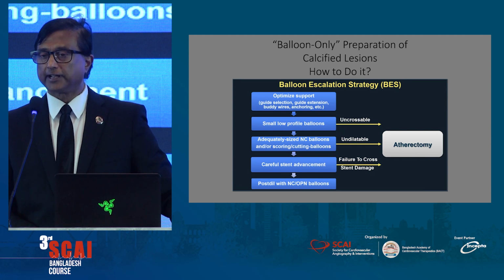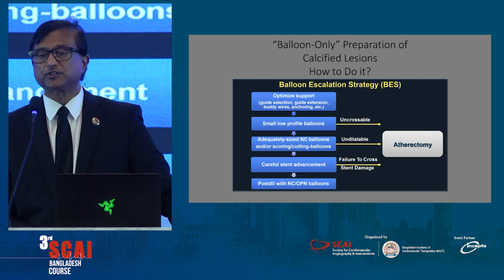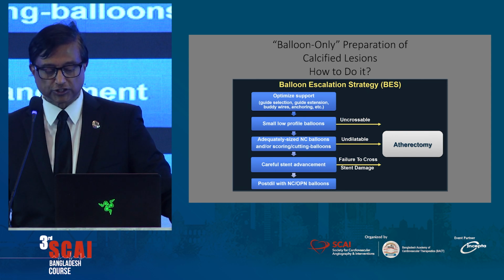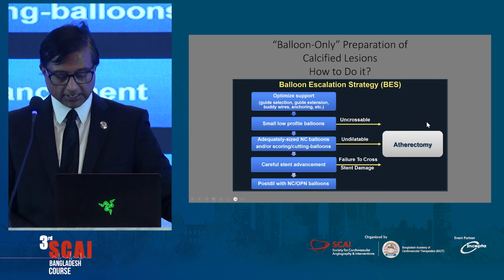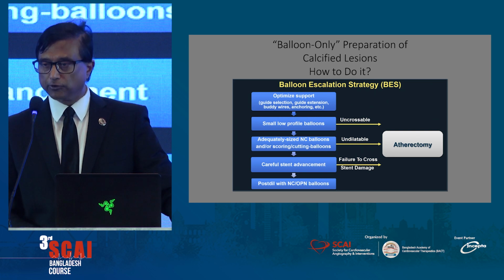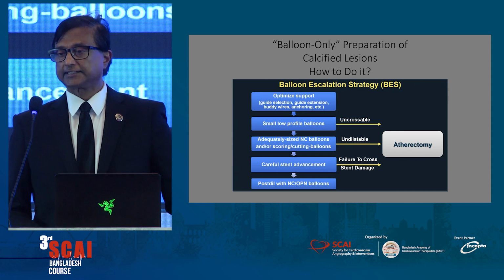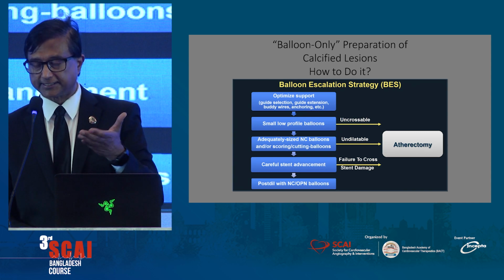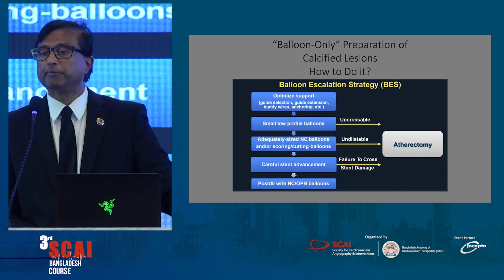You may hope for it, and many times you may be able to get away with it, but sometimes you may not be able to get away with it. So it is better to prepare the vessel right. And we have other tools: a simple non-compliant balloon or a scoring balloon, or now we have the excellent tool, if the balloon crosses, you can use the lithotripsy shockwave balloon.